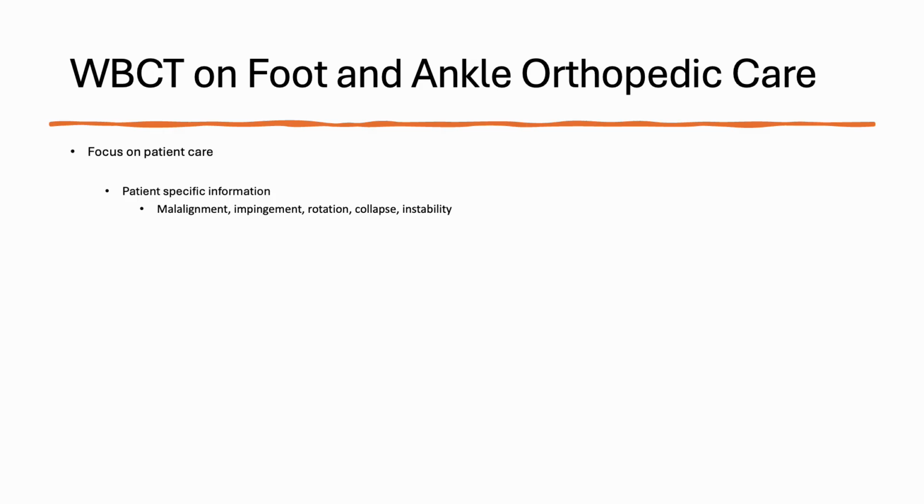You don't have to get it on every patient. I typically do it on most of my patients that I'm doing surgery on, and again, not every patient. So if I'm just doing hammer toes, I'm probably not going to get a weight-bearing CT scan. But if it's any deformity, any flatfoot, any questionable bunion, any total ankle, any custom implant, I'm getting a weight-bearing CT scan as long as they can.